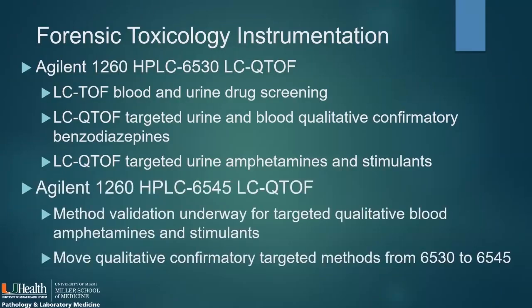And for the Agilent 1260 HPLC coupled to a 6545 LC QTOF, that is our new instrument. So we are in the middle of validating methods on that instrument. And our plan is to move all of our qualitative confirmatory targeted assays from the 6530 to the 6545.